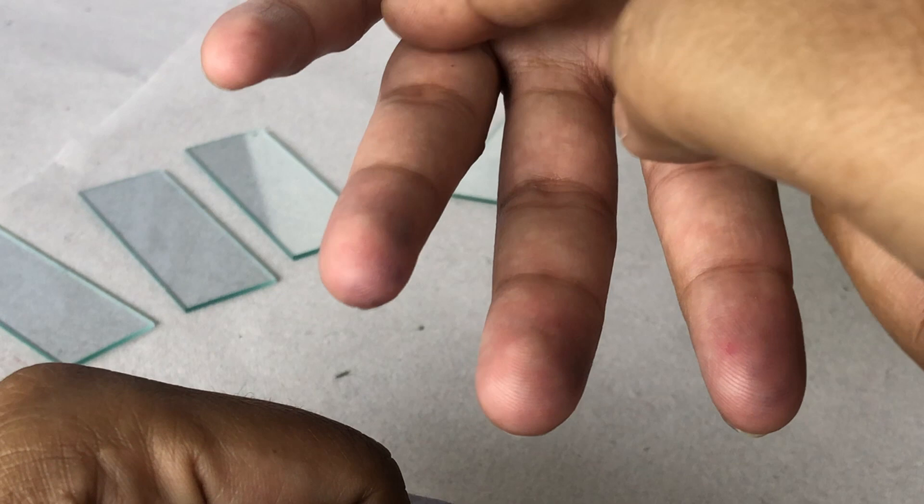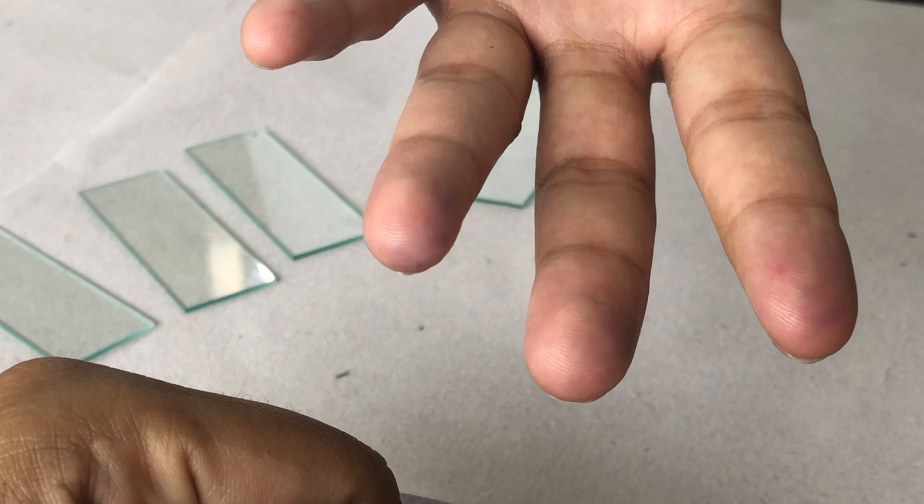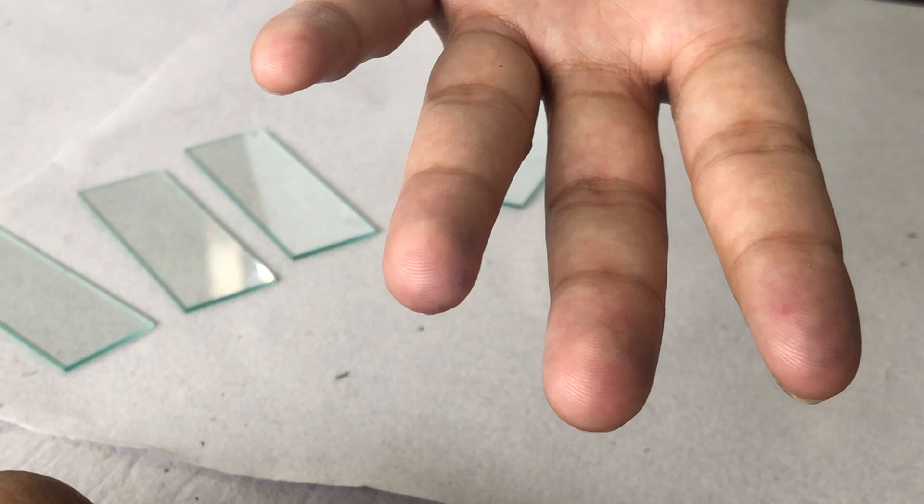These three fingers have fascial compartments which are ending around here. We can prick any of these three fingers, but generally the index finger is used for various day-to-day activities. So, the preferred fingers are either of these two, the middle finger or the ring finger.